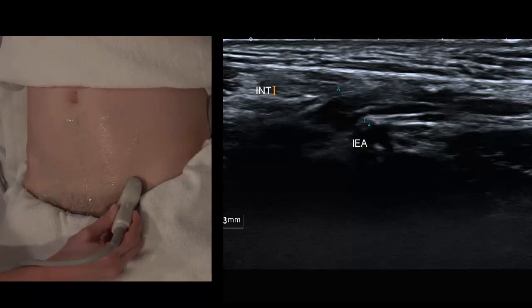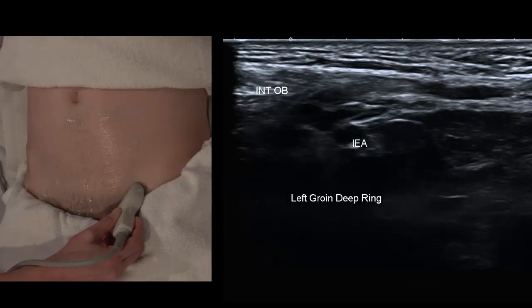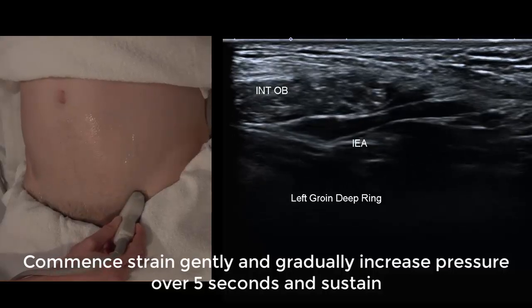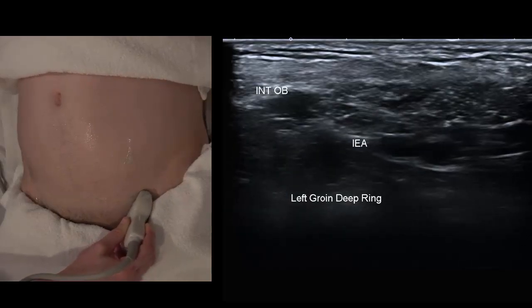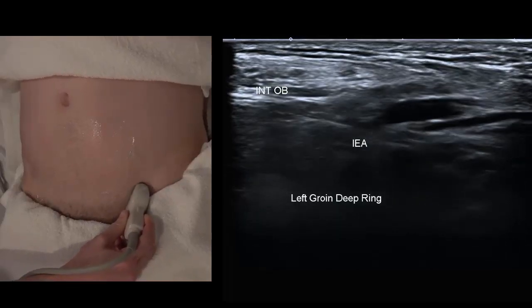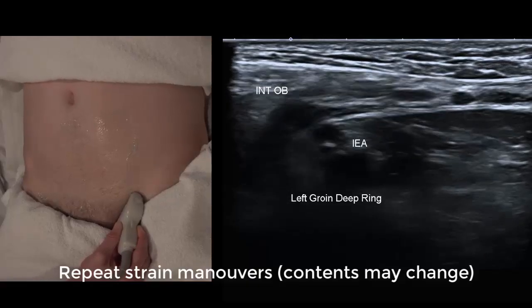This is identifying the deep ring on a relaxed view. If a hernia comes through here it's an indirect hernia. In a male, up to 10 millimetres is quite normal because of all the contents that have to be allowed through. With a gradual strain, that gap is widening — beyond 10 millimetres there's some intra-abdominal peritoneal or omental fat protruding into the deep ring. It may only partially protrude, making it a partial hernia, which easily compresses back with probe pressure.